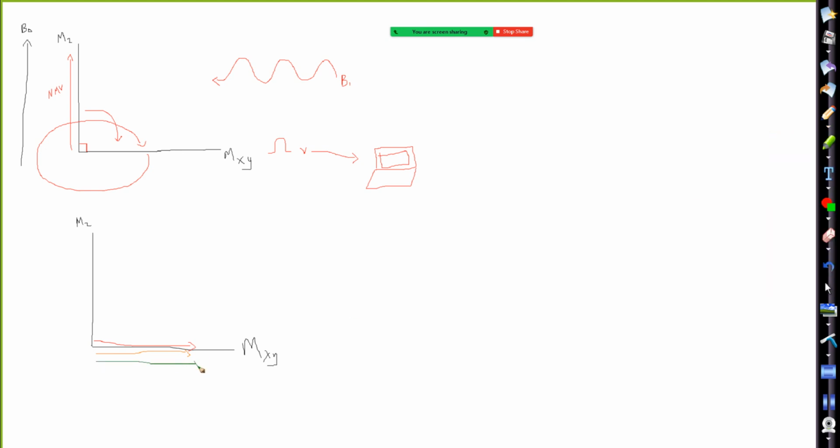Okay? So at this point, all those vectors are in that transverse plane, and you have that entire vector of that tissue. Do you think at this point we get any kind of contrast with those tissues? No, because they're all at 100%, right? We need to see different shades of gray and different signal strengths, right?